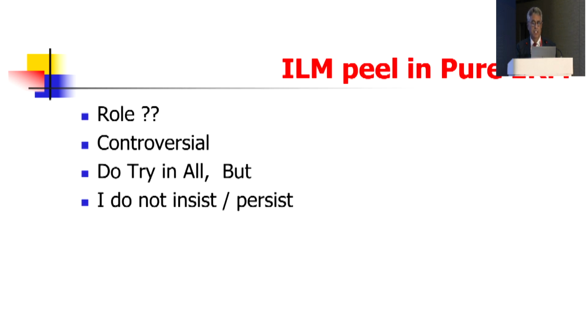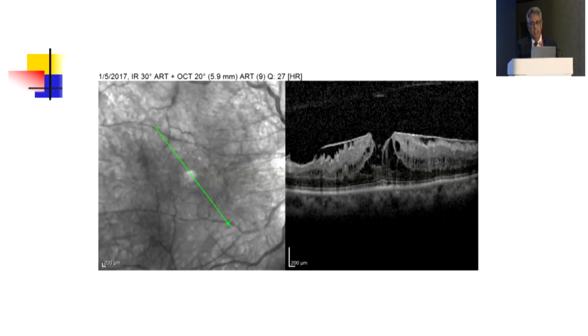because of cataract. And another thing is ILM peel. We have all become ILM addicts, wanting to peel ILM in all patients, but it's not necessarily required in patients with epiretinal membrane, because in the pathology of epiretinal membrane, epi means upon the retina, whereas ILM is definitely part of the retina. Even if you see global trends, there's no advantage of removing it. The only advantage of ILM peel is that it ensures that all membranes in front of the ILM have been removed. So this was a patient who had epiretinal membrane and an attempt at lamellar hole formation also.